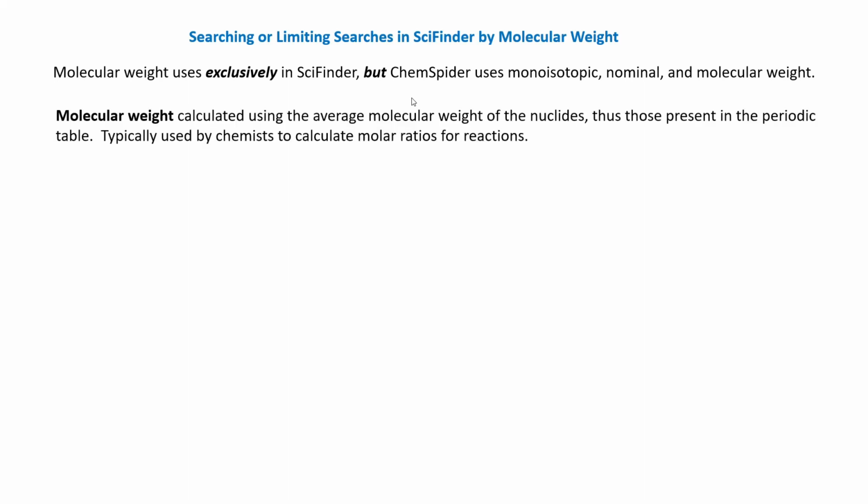Molecular weight is calculated using the average molecular weight of the nuclides, thus those present in the periodic table, typically used by chemists to calculate molar ratios for reactions.